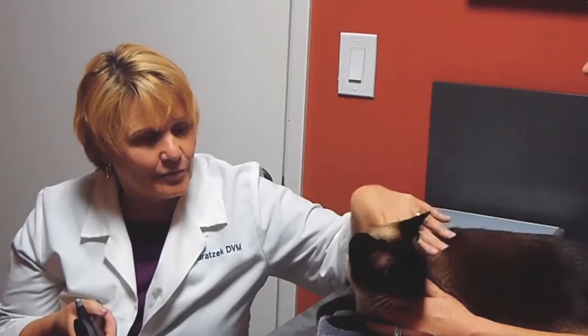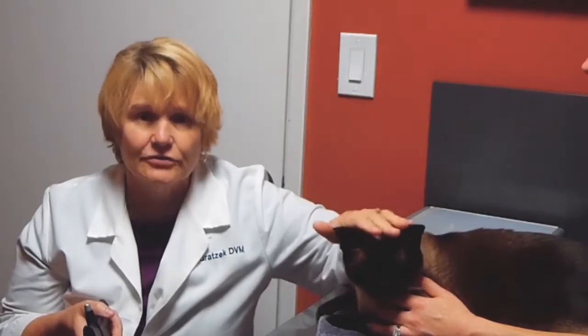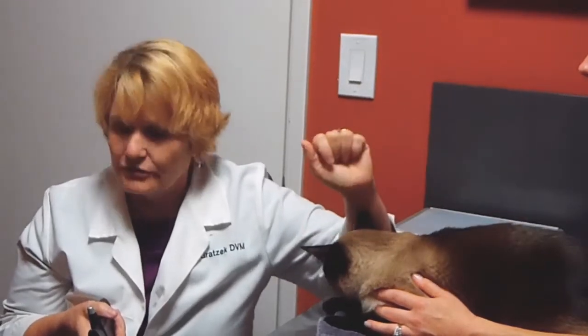The Rebound Tonometer is a fabulous tool to evaluate pressures in frogs to elephants, and it's a very non-stressful diagnostic tool, easy to use, and we're going to show you how to use it.